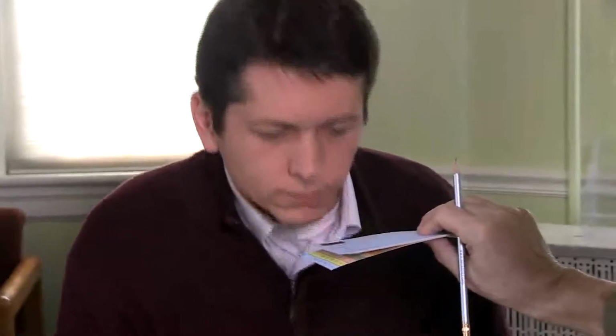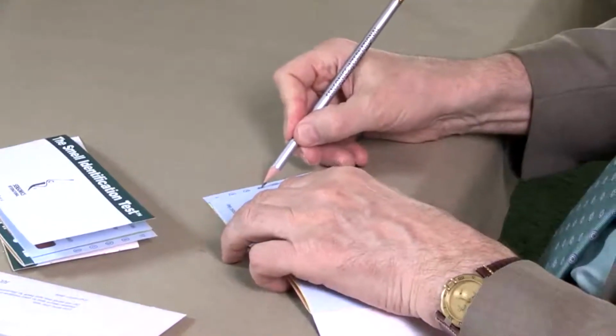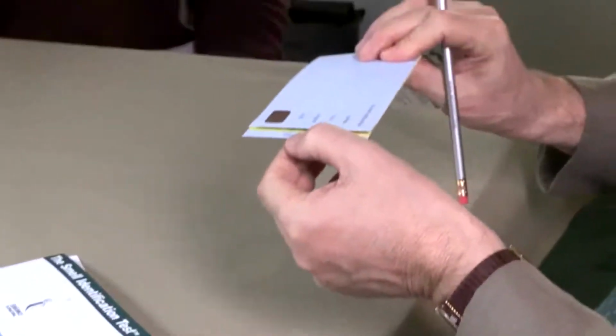So it's very simple. Mistakes are made sometimes. People will scrape open the scratch and sniff label too much, and it will smell more like pencil than the odor it's supposed to smell like. So my usual strategy is to make a Z with a couple lines through it, and then I give it immediately to the patient and say, this smells most like gasoline, pizza, peanuts, or lilac. Pizza. Pizza, okay? Then that's the third answer down. We fill in that answer nicely and completely.